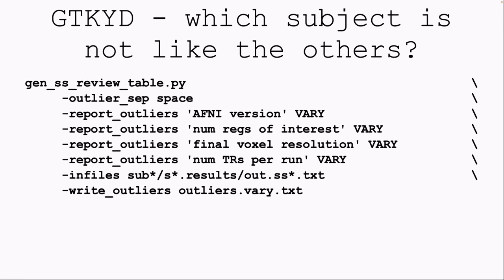You also want to have final voxel resolution all be the same. The number of TRs per run will generally be consistent across subjects. And you'll want to know these kinds of things.